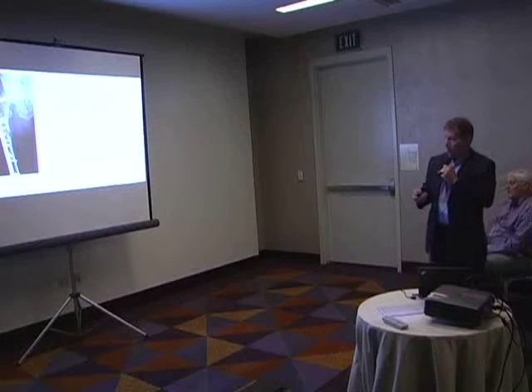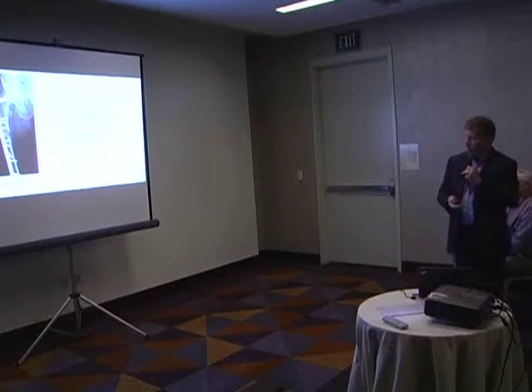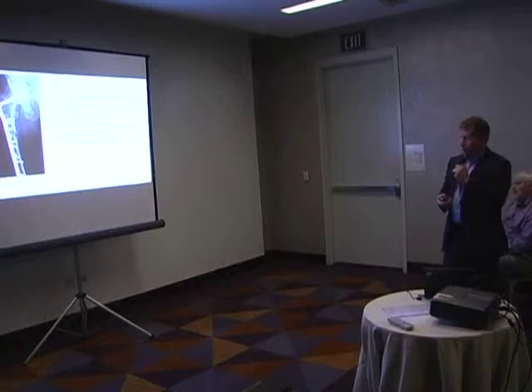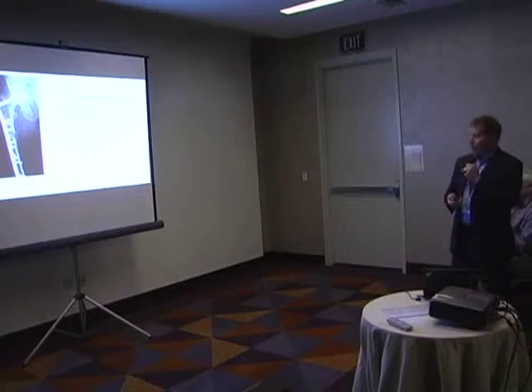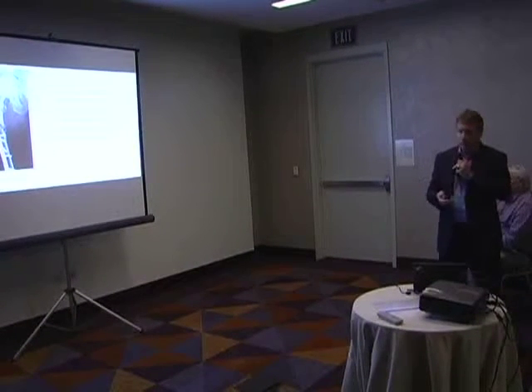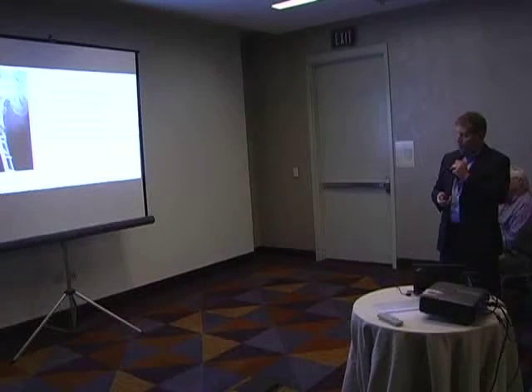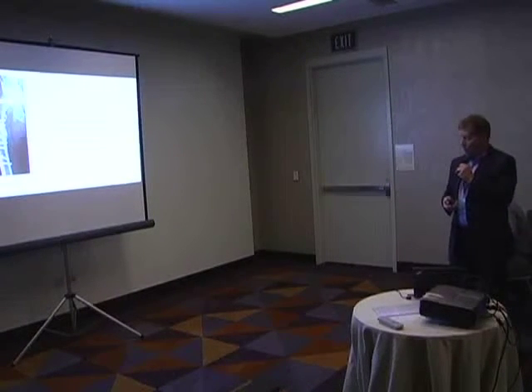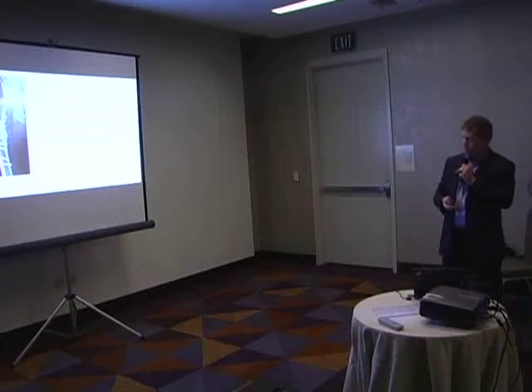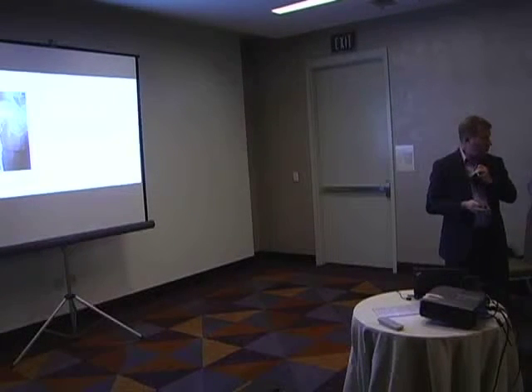Here's an example of a complex subtrochanteric fracture in a 66-year-old male thrown from a horse, treated with a blade plate, and was told to begin weight bearing 8 weeks later, and was seen at 6 months with continued pain. Apparently revision surgery was offered, but the patient declined, and so a minimally or non-operative approach was recommended, and treatment with the capacitive coupling device was initiated. Then at just 2.5 months after that, you can see improved callus formation across the fracture site. After 4 months of treatment, 10 months post-injury now, the fracture looks like it's well healed.